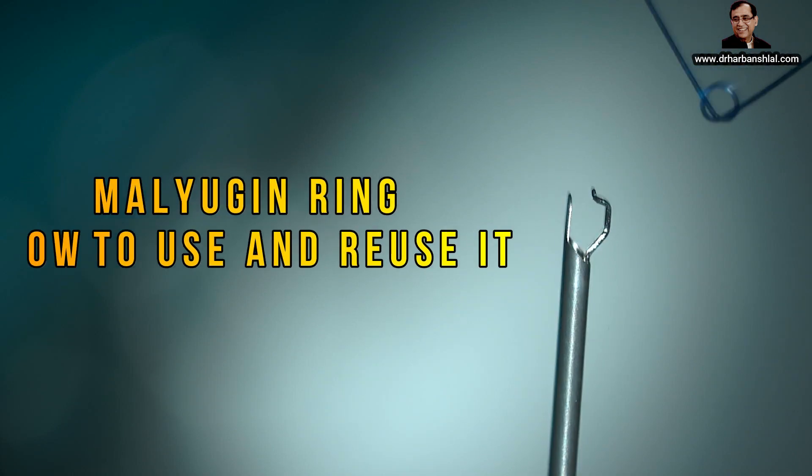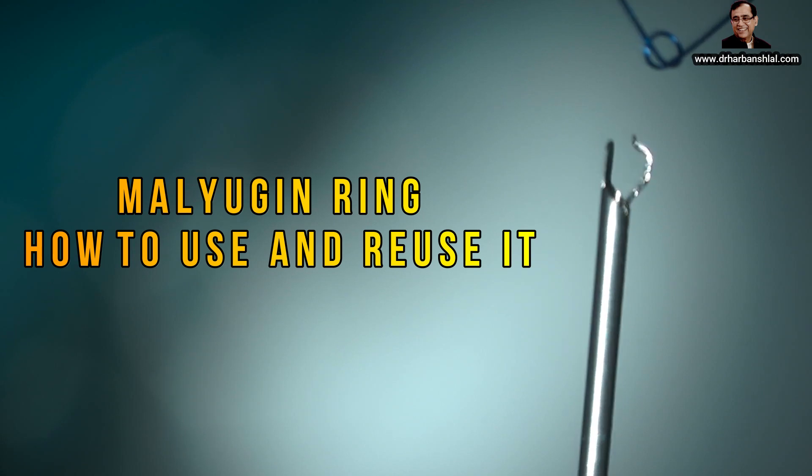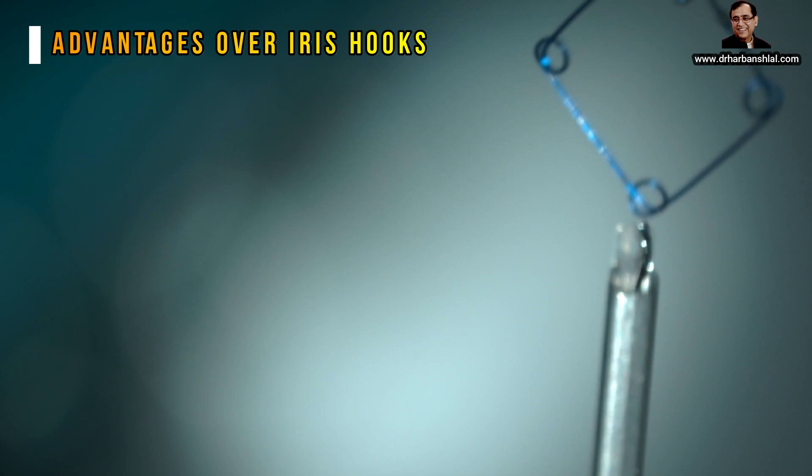Dear friends, today we are going to talk about the Malugan ring. It is used as an iris expander. It has got many advantages over the iris hook.